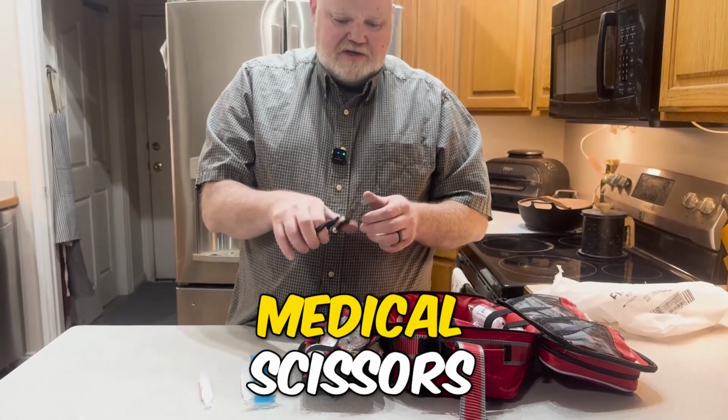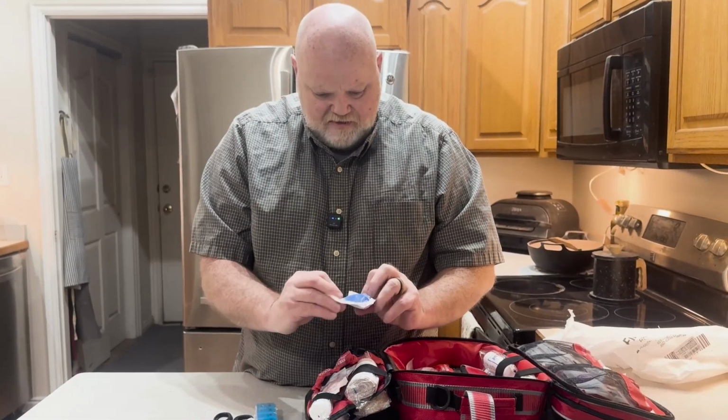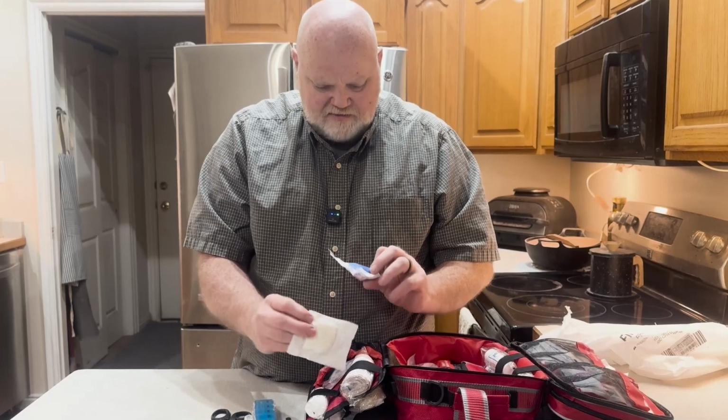Pair of medical shears. They're a little small, but they'll work. Yeah, these will definitely cut belt loops and stuff. Good pair of tweezers, a couple pairs of gloves. I would add some more gloves.